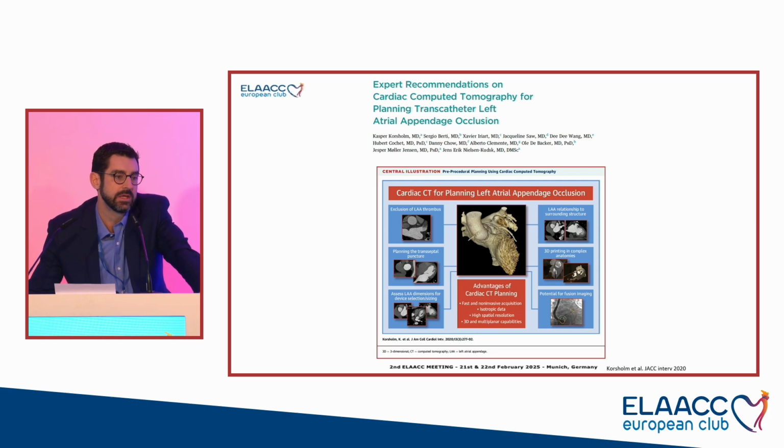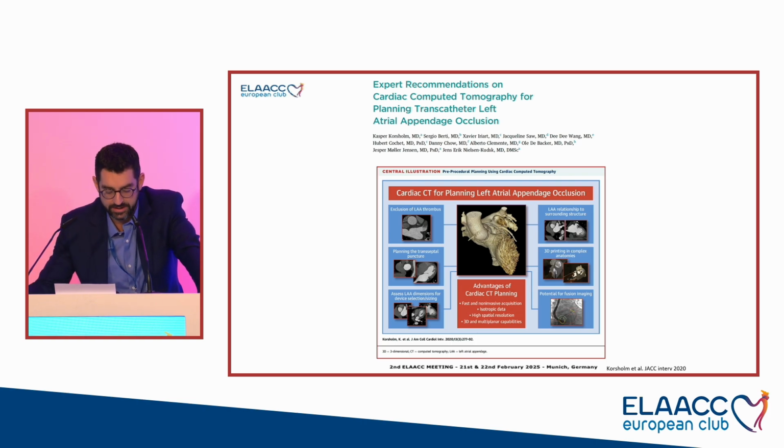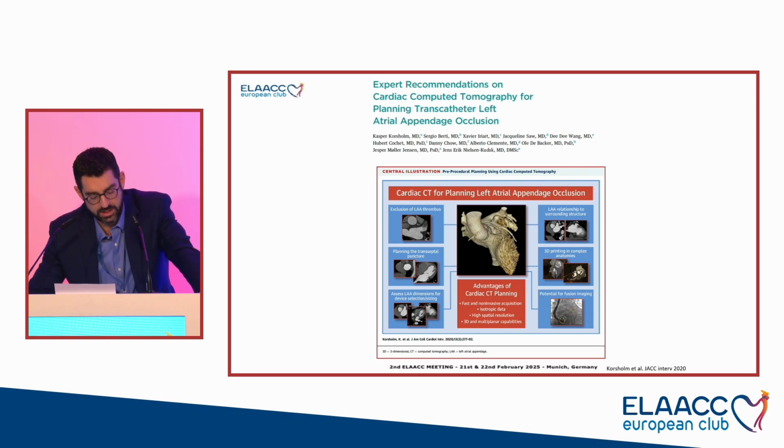And this is maybe due to the collaborative work led by Kasper and Jens Erik, published in 2020 in JACC Intervention. And you probably all know this paper that underlines the advantages of the CT cardiac planning regarding all the anatomic and morphologic features of the left atrial appendage.